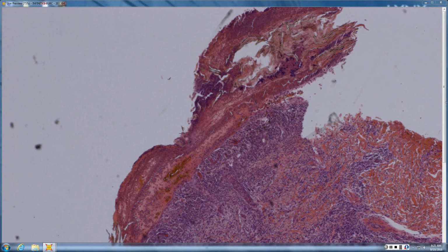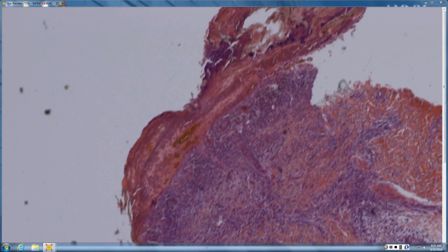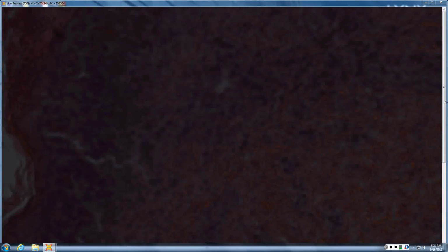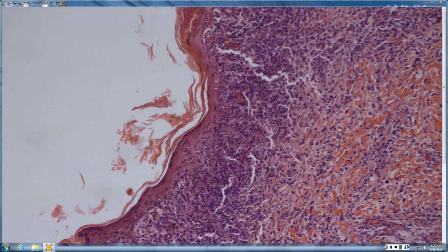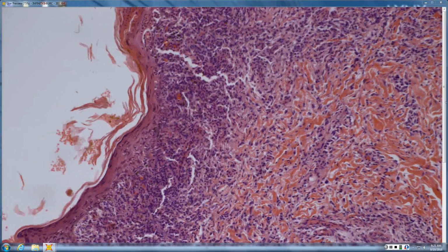Alright. So this looks lichenoid, it just looks obliterated. A lot of scale crust on top. Lots of scale crust. Pretty robust interface though. Right. How about, tell me about your dermis here.